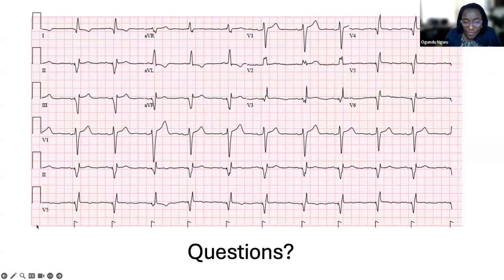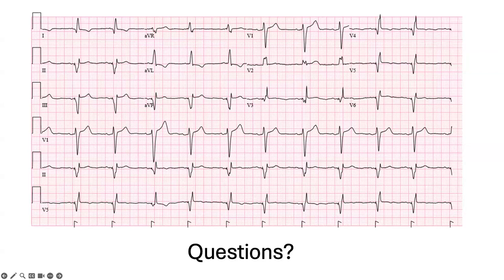There's a question from Julius. Oh, hi, Dr. Ingo. I was just making a point, and then I think my colleague Gerard chimed in as well. When you're speaking about the PNS and trying all the different vectors, I've tried maybe all the different vectors, and the patient was still getting diaphragmatic twitches. What I did was lower the pulse width slightly and put their voltage up only slightly, which achieved threshold, but the PNS disappeared.